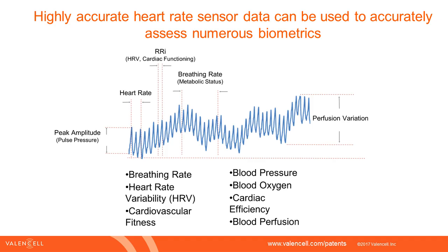This blue plot here is a plot of a PPG waveform. It actually is an inverse plot that comes out of a sensor. I believe this PPG data is actually my own, from a breathing control session I had. If you look at this PPG data, there are a number of different pulses in here, eyeballing it, maybe about 40-something pulses inside this PPG waveform.